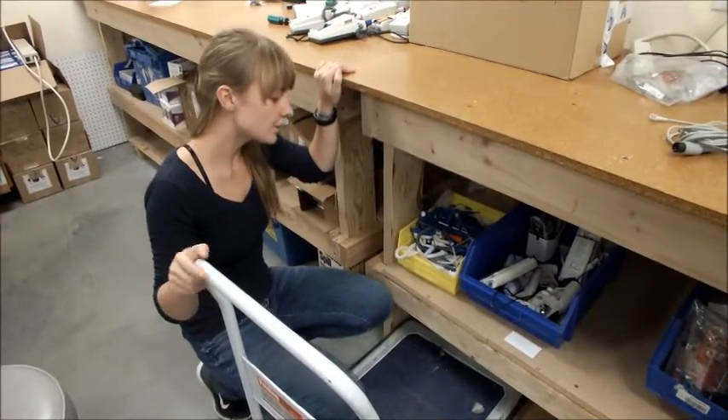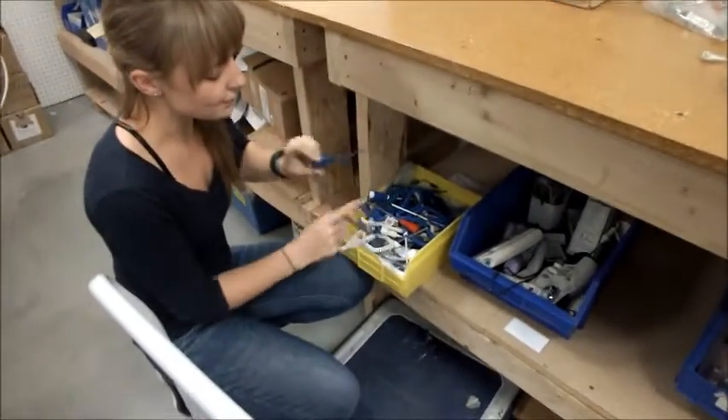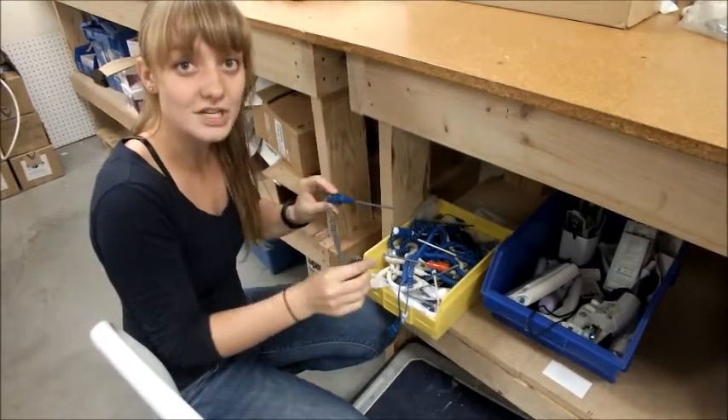If your device tests temperature, you're going to need to look for this yellow box in the lab that has temperature probes that look like this. From this, you're going to look for the right attachment to go with your machine.